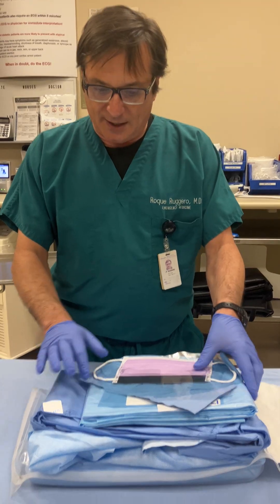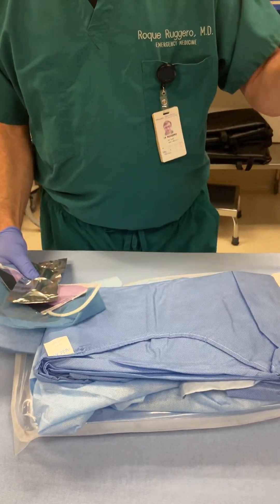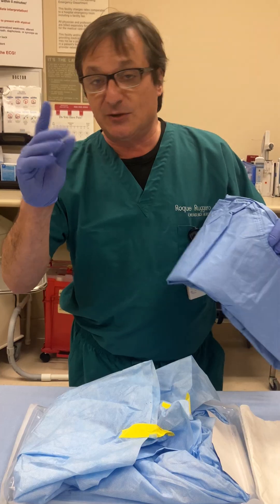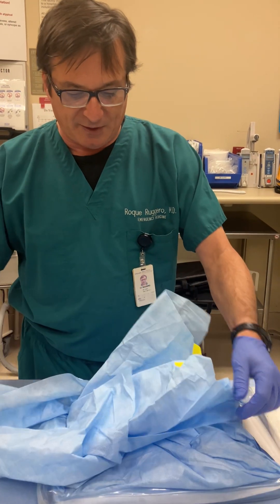I've opened my central line kit. I would be placing the sterile drape on the patient. I would be placing a sterile gown, and I would have sterile gloves in place — not nitrile gloves.